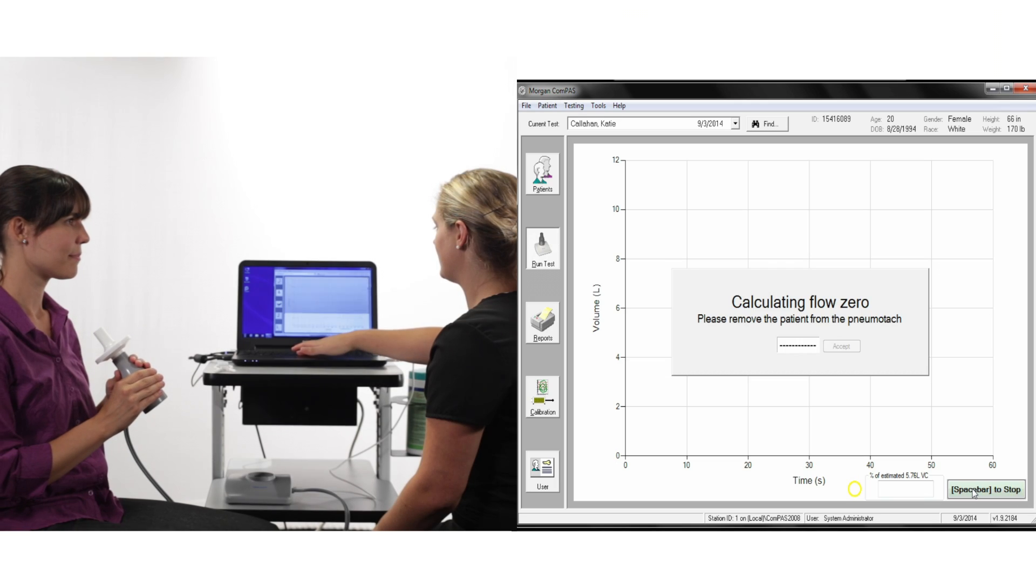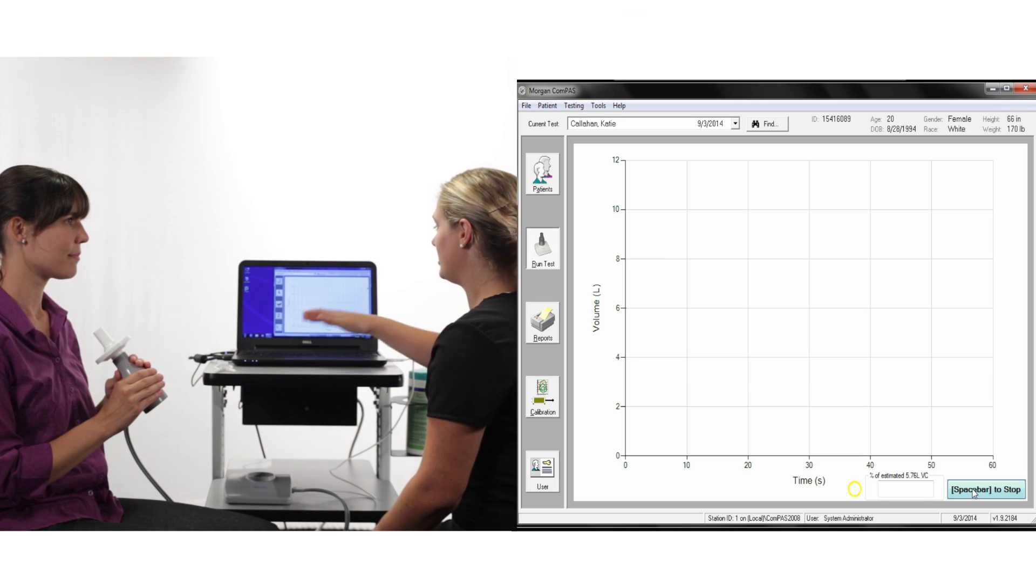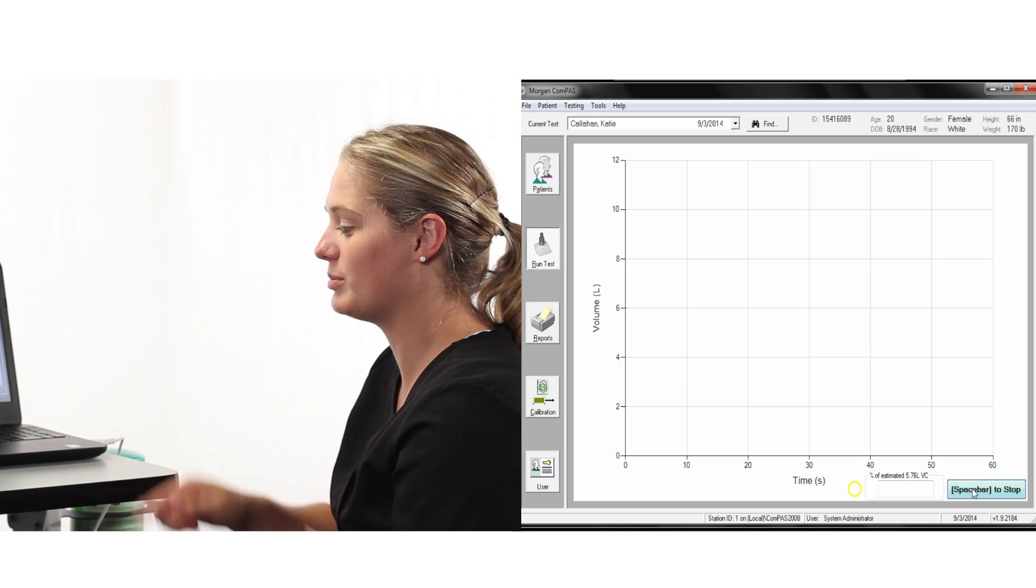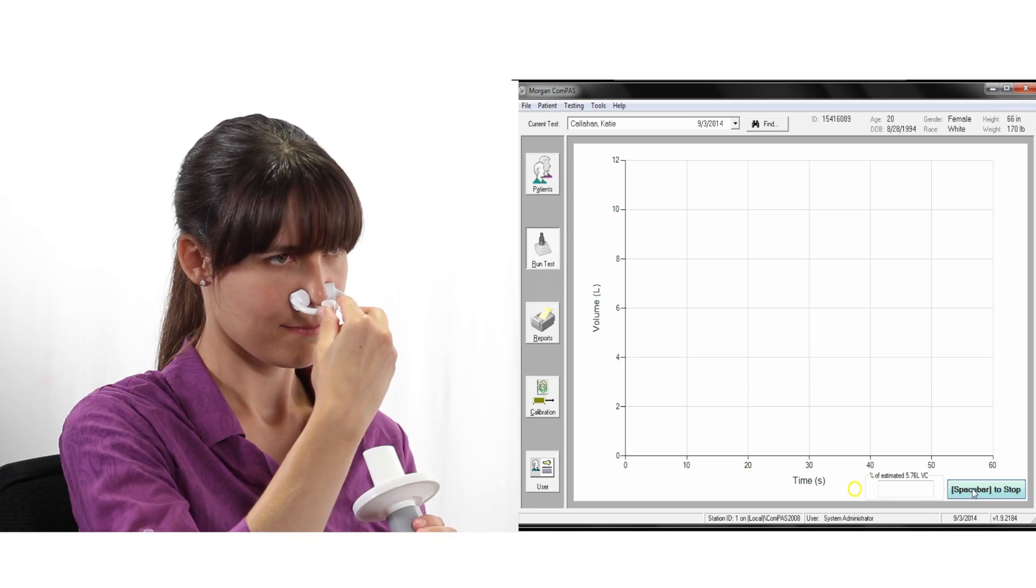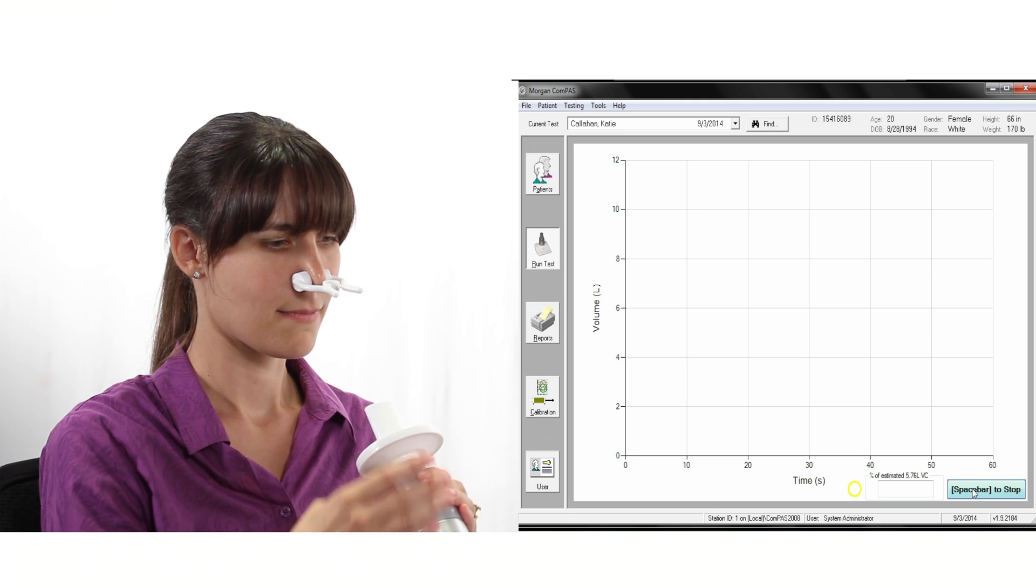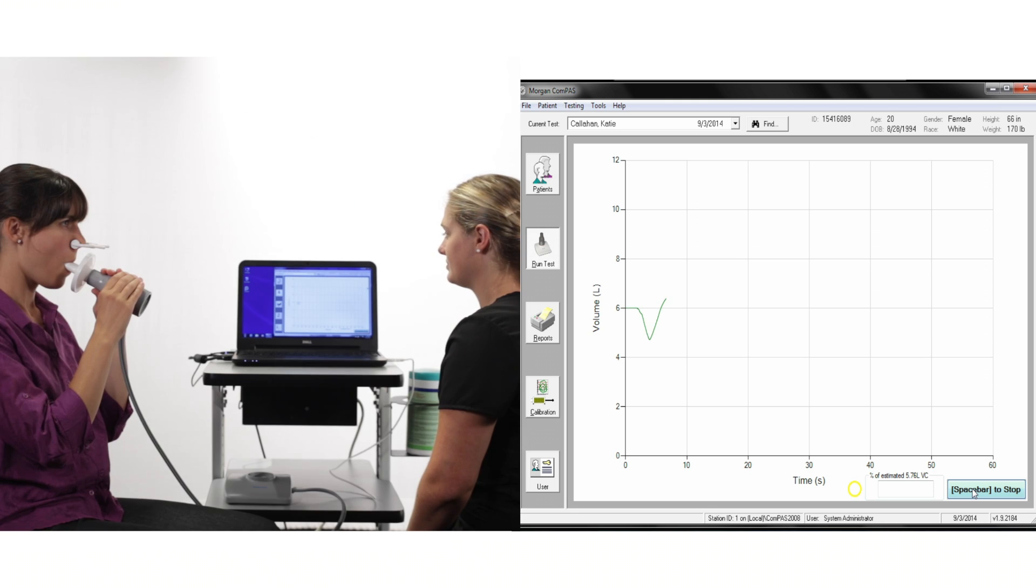To begin SVC, make sure the subject is sitting upright and is wearing a nose clip. Begin the test with normal breathing.